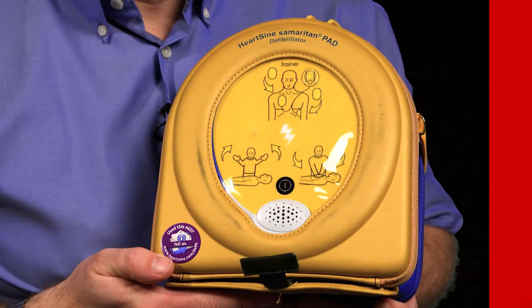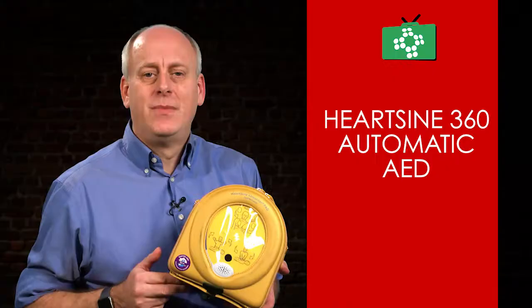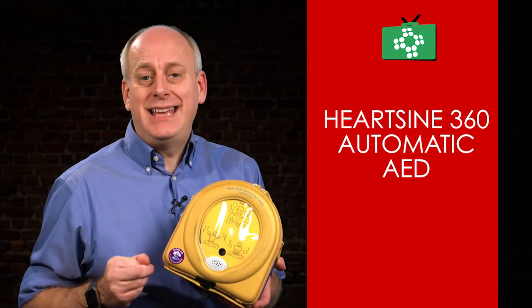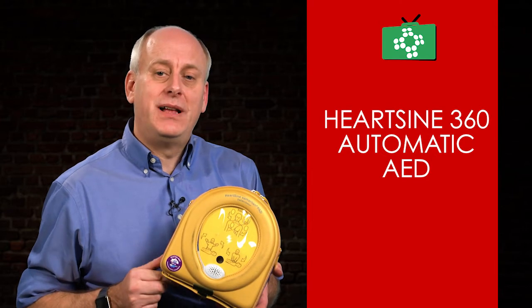It looks very similar to the Samaritan Pad 350p, but the 360p is automatic rather than semi-automatic. This means there is no shock button on the 360p, as the unit will detect if a shock is advised, then give the warnings and deliver the shock automatically without the need to push the shock button.